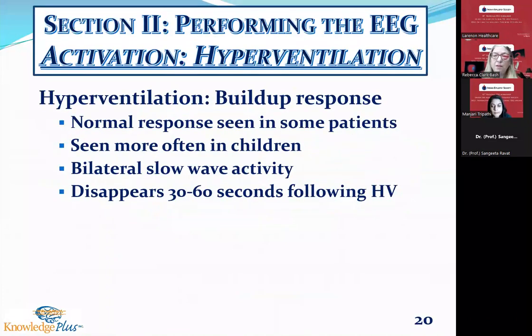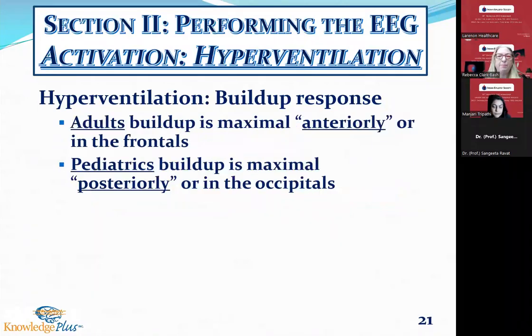The normal response to hyperventilation is called a buildup response. It's normal if it's present, it's normal if it is absent. It doesn't matter. If it's there, it's okay. If it's not there, it's okay. It's most often seen in children. It's bilateral slow wave activity, has no sharps, no spikes to it. And it disappears at about a minute. You shouldn't have any more sign of buildup.